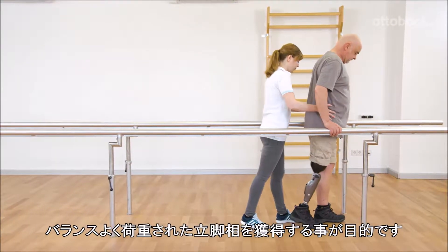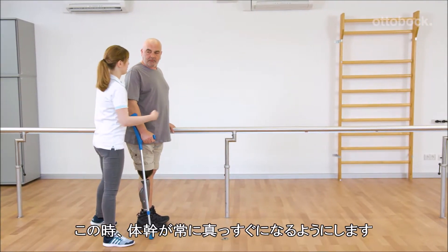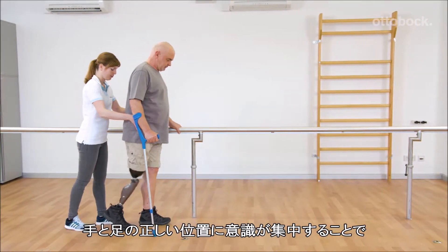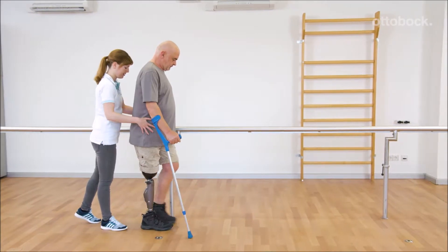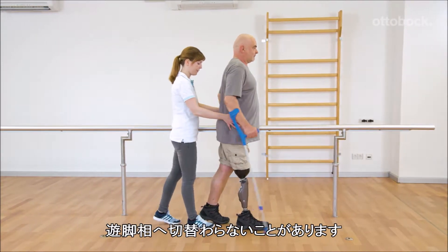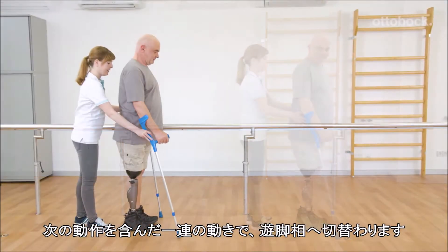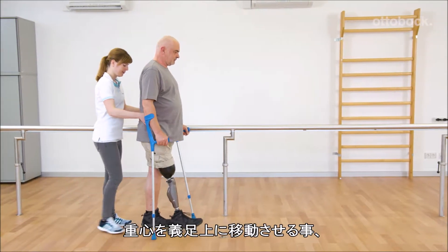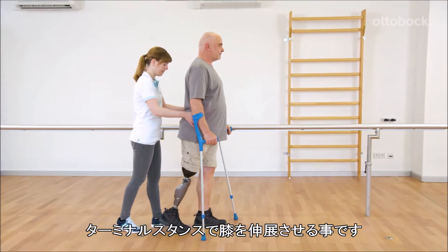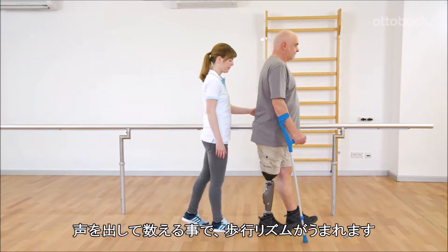The aim is to achieve a good stance phase with equal weight distribution. The trunk remains upright during the entire process. Due to the increased focus on correct hand and foot placement, a discontinuous movement pattern may occur and stance release may not be triggered. A fluid motion sequence triggers stance release, which includes shifting the centre of mass over the prosthetic leg and knee extension during terminal stance. Counting out loud supports Gerhard's coordination of a fluid walking rhythm.